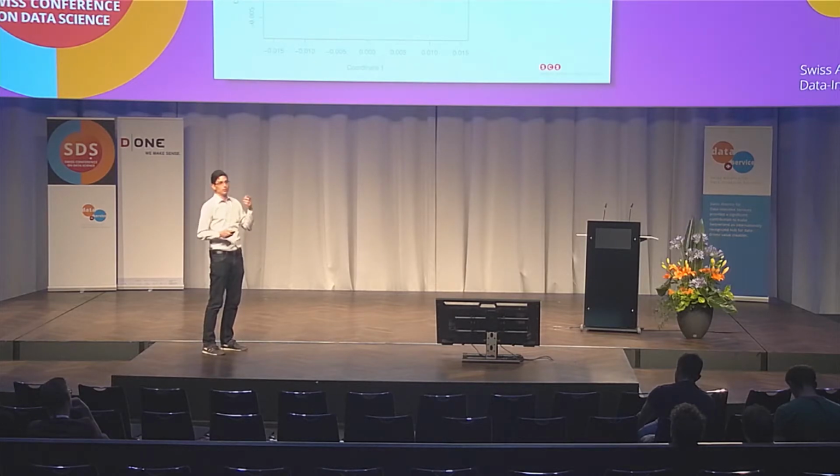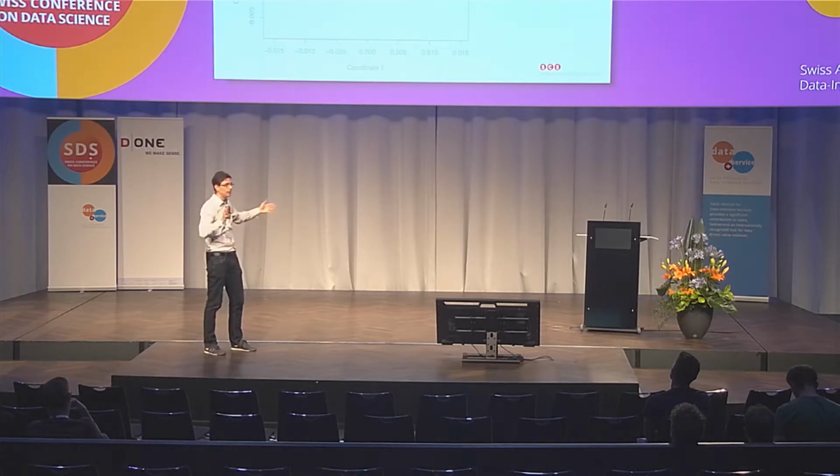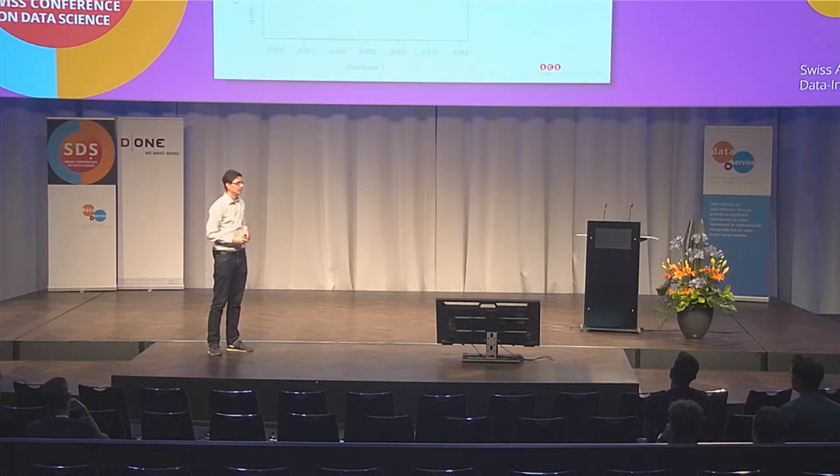Now this plot basically visualizes the similarities between different labels. If we have 2 points, and if they are close to each other, that means the labels which they represent are similar to each other. If the points are far away from each other, then the labels which they represent are different from each other. Now you might ask yourself, why is there 1 point for the CNN, and why do we have 3 ground truth points? Usually we only have 1 ground truth set, so we would only have 1 similarity between the ground truth and the CNN. In our case, we asked the expert ophthalmologist to label the test set the 2nd and the 3rd time.